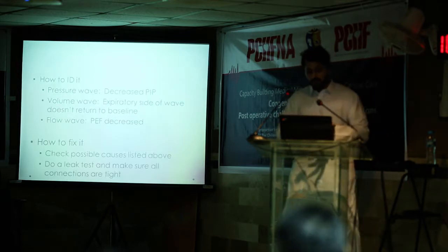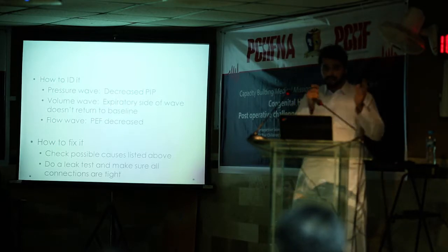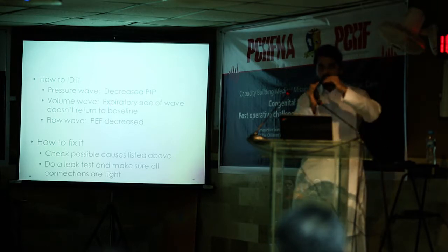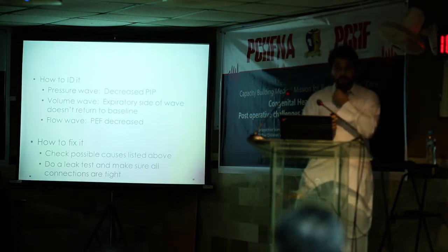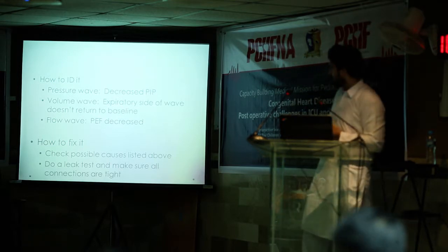So how to fix the leaks? There is something we call a leak test in the ventilators. If we do that, that will make us safe from the ventilator side. We will say, okay, the ventilator has nothing to do with it, we will check the circuit, we will check the ET tube cuff leak, so we can do this to fix the problem.